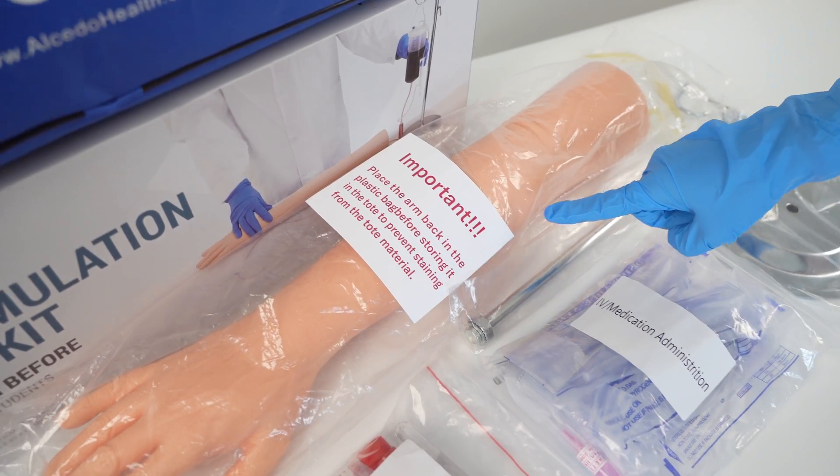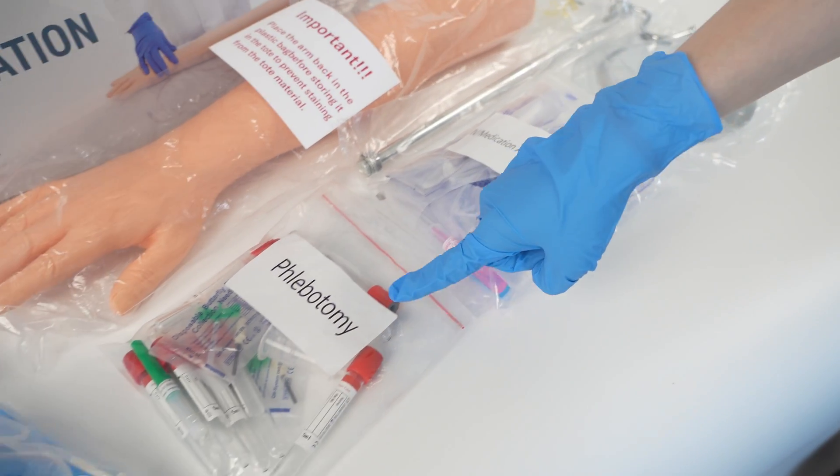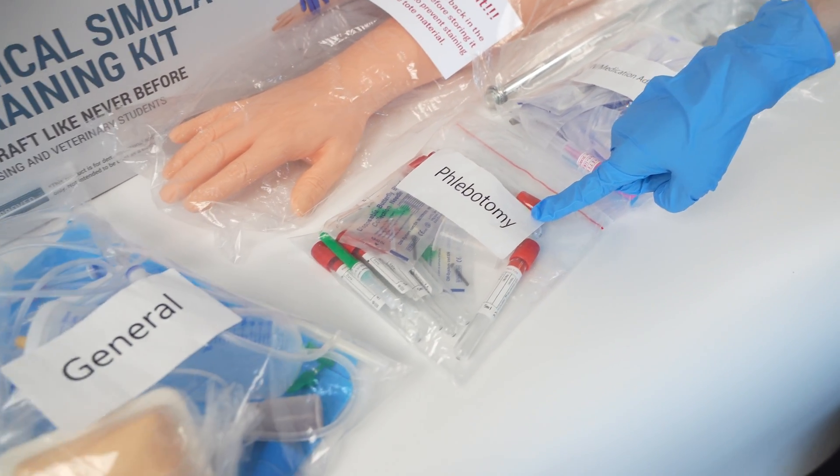The IV Simulation Arm, IV Medication Administration Pack, Phlebotomy Pack, and General Pack.